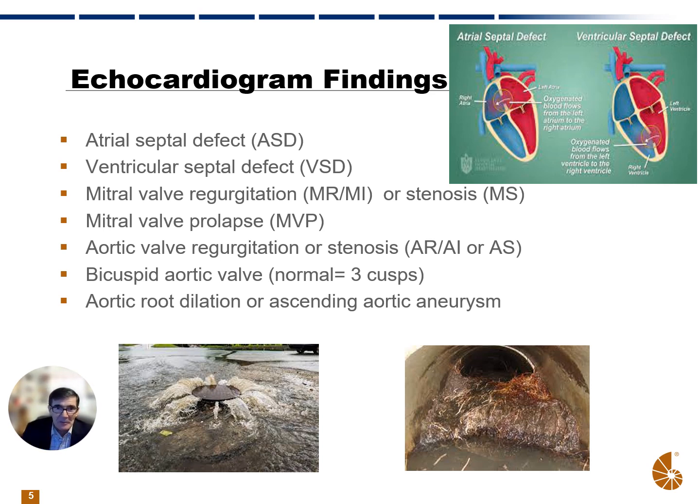And as we talked about, does the water, or the blood, the water in the picture to the bottom, regurgitate back through the valve, just as blood would regurgitate back through the mitral valve? Or is there stenosis? So it's difficult for the blood to pass through the mitral valve, and it's blocked.